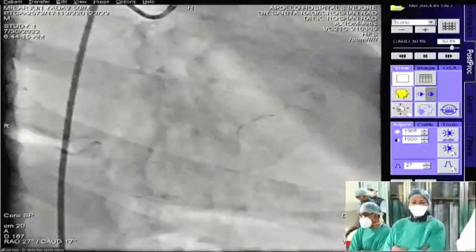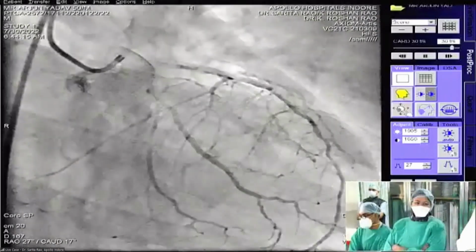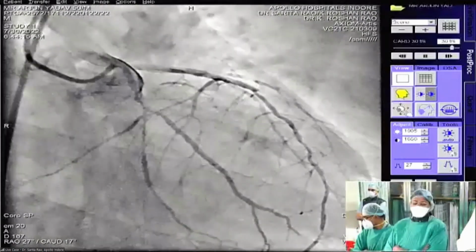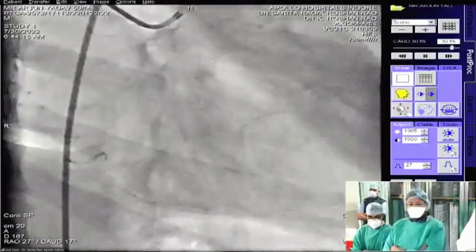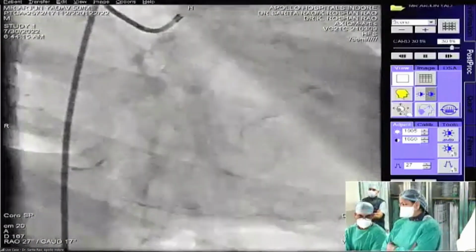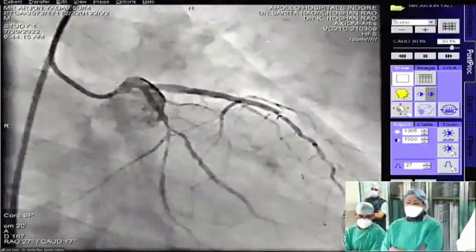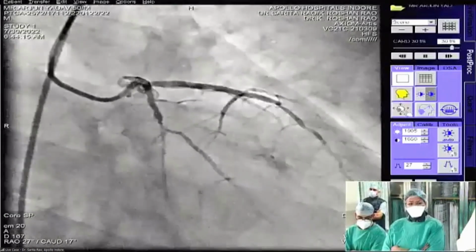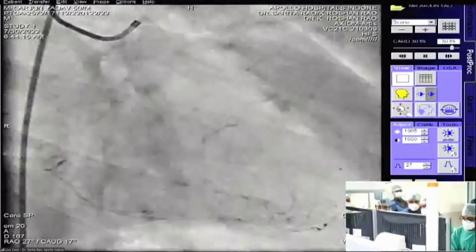He's been to several surgeons. The risk was too high for him. He's having resting angina. Does he really have any other choice with this angiogram, except that a cardiologist like you would take him up and relieve him? So yes, I'm willing to take the risk because this patient has no other choice.